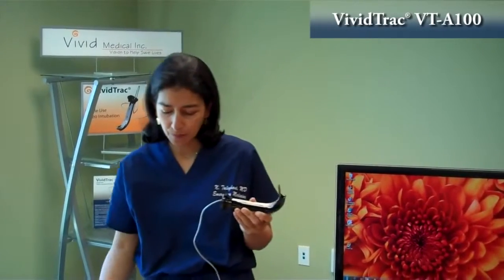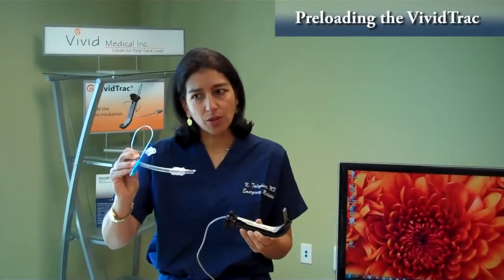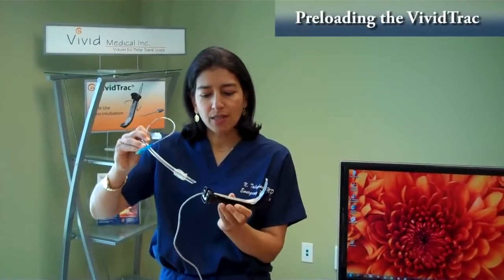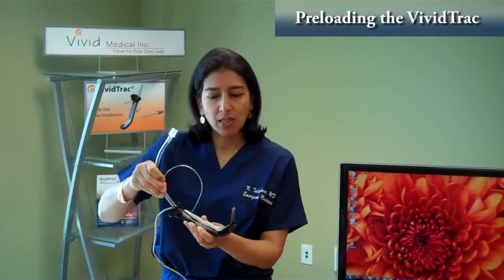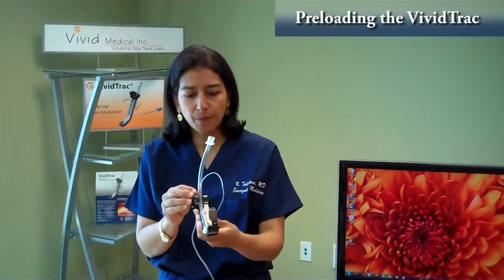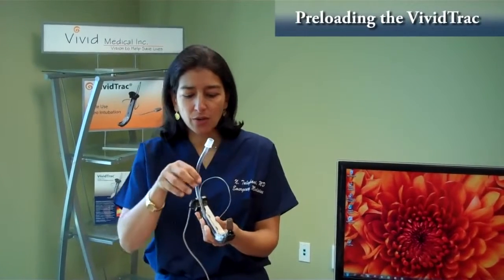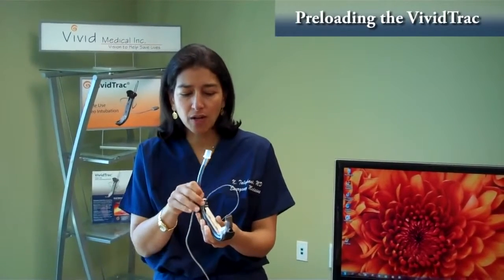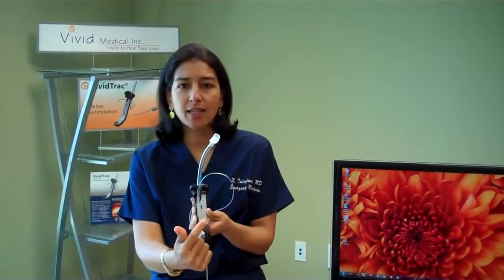To load the ET tube, you want to pre-lubricate the tube, turn it 90 degrees towards you, and begin the insertion process from the top of the channel. You gently push the ET tube in, and the channel will guide where the ET tube should go. You want the distal tip of the ET tube to align with the channel, so if you find that you've pushed it in too far, just pull it back so that it aligns with the end of the channel and not the end of the blade.